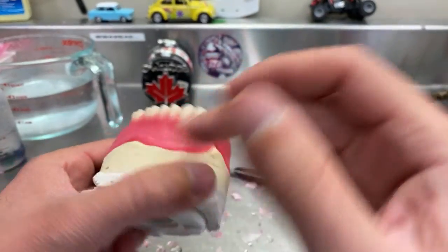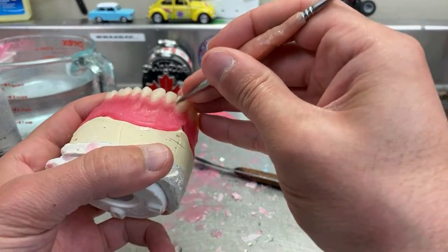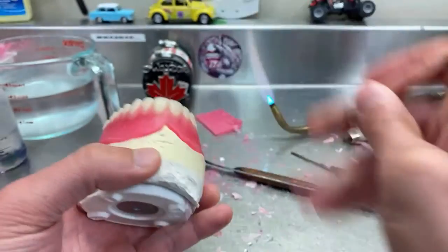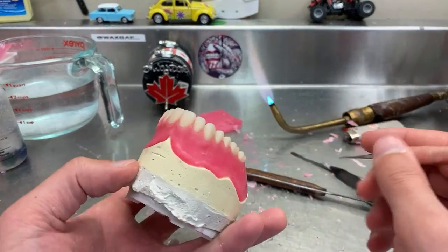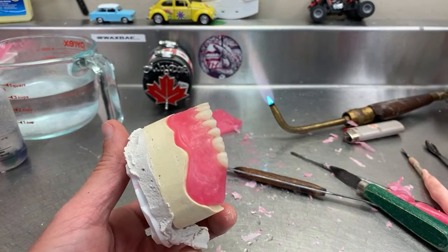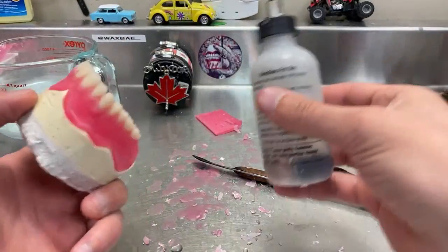Make sure there is no carving wax stuck between the teeth or anything. Because once you flame it, it will be hard to change everything, because now everything is going to be smooth and you cannot go back and change it. So you have to be very careful.